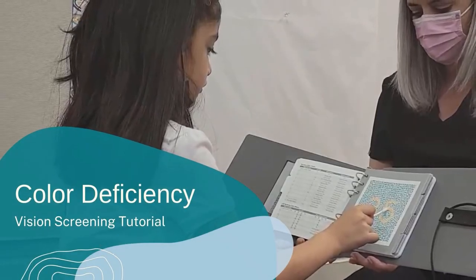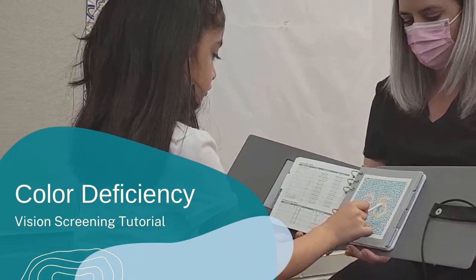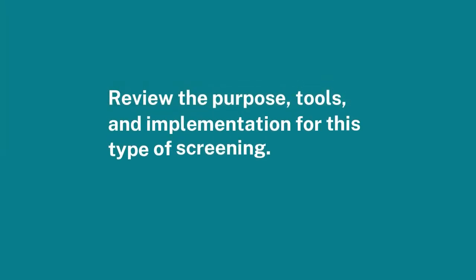Welcome to the color deficiency vision screening tutorial. In this short video, we will review the purpose for this type of screening, the tools used, and how it is implemented with children of various age groups.